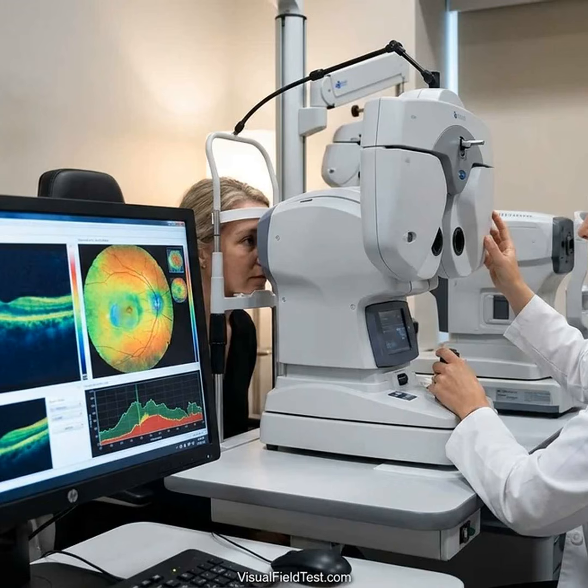Once your RNFL is around that thin, the scan can't reliably tell if it got any thinner. The readings bottom out. In practice, this means if an eye has severe nerve loss, serial OCT scans can start to appear stable even when glaucoma is worsening. The OCT graph just stays flat at the low end. Thus, OCT becomes less useful as a progression detector in very advanced glaucoma because it may miss continuing damage.